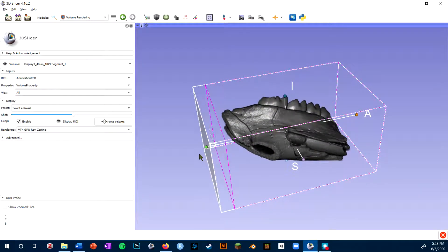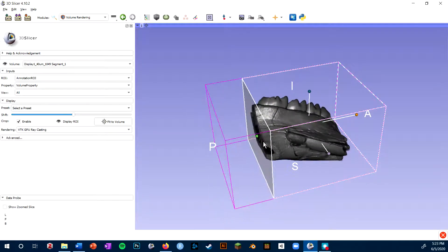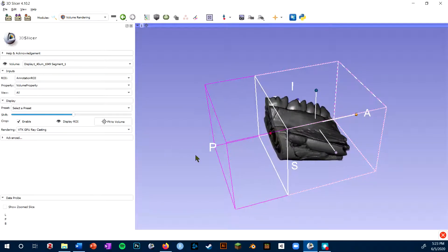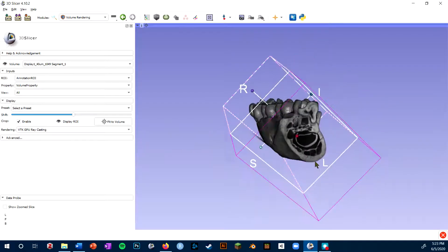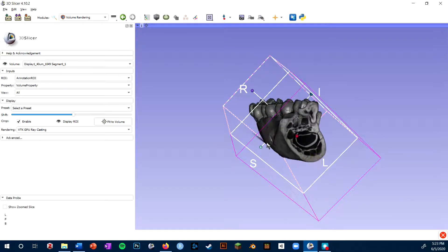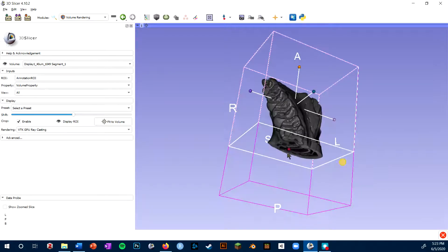I can pull the handles and crop the specimen to wherever I like, and then I can see inside the anatomy at that point.